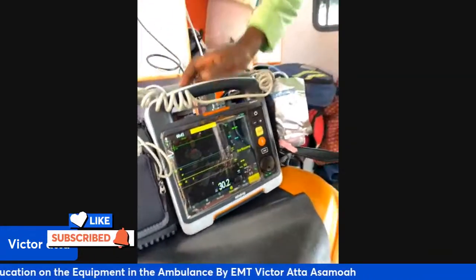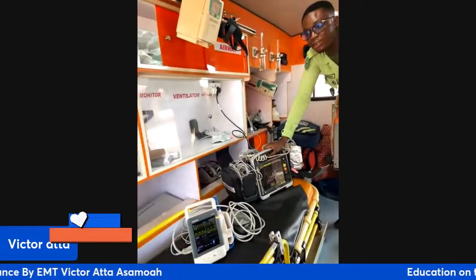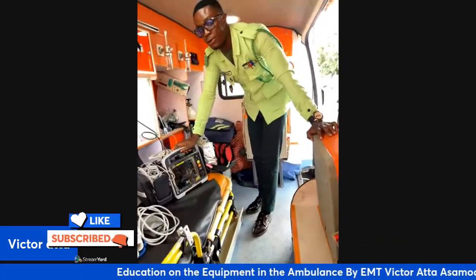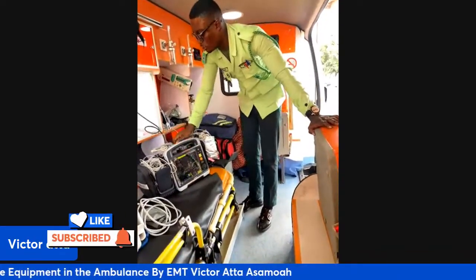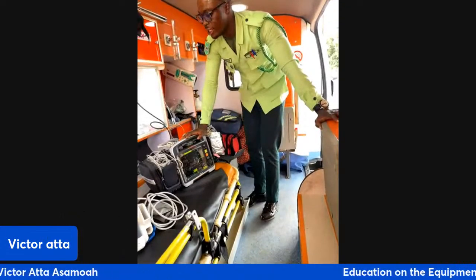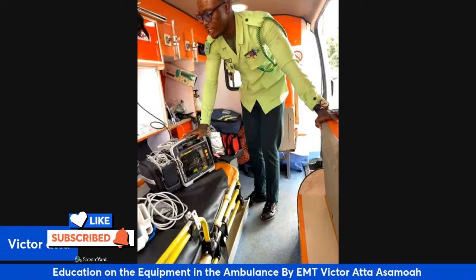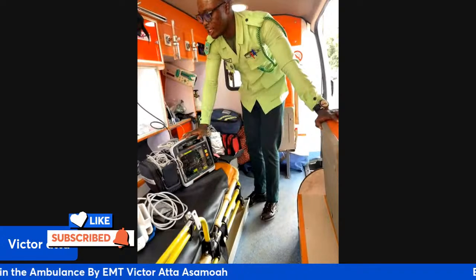It also allows you to deliver a shock. It also serves as an automated external defibrillator. When you are transporting a patient and the patient becomes unconscious, when you're trying to revive or resuscitate your patient, this machine can serve as an AED.